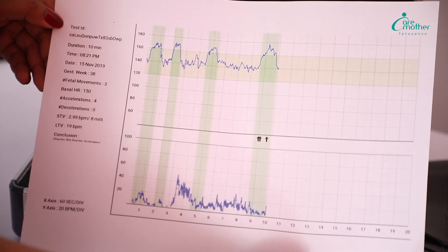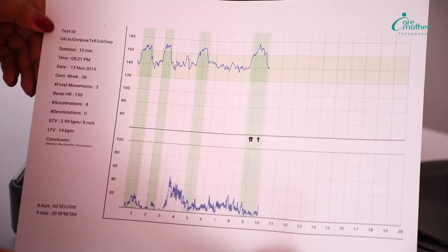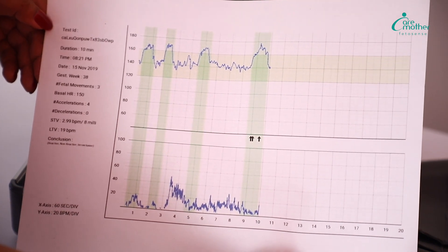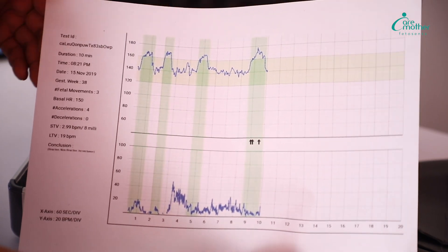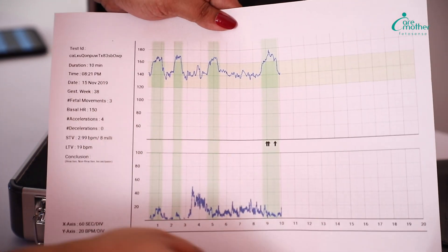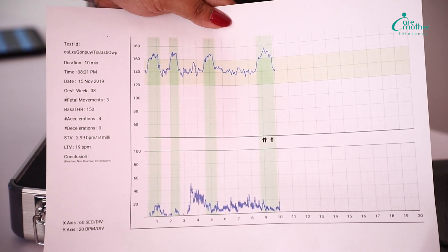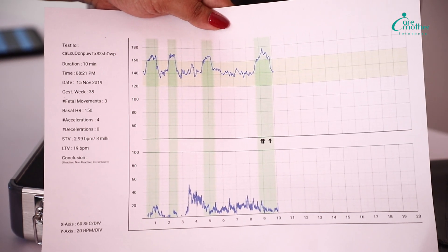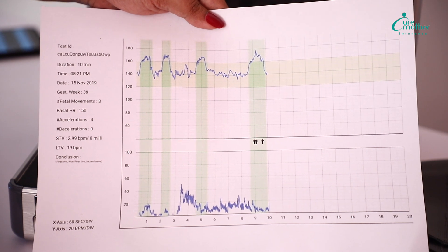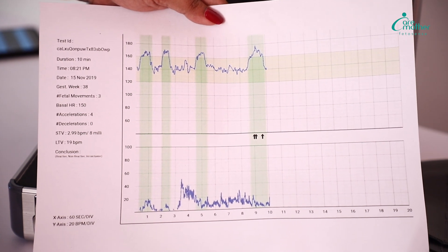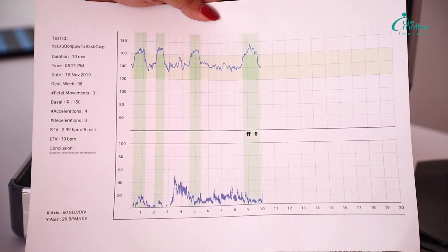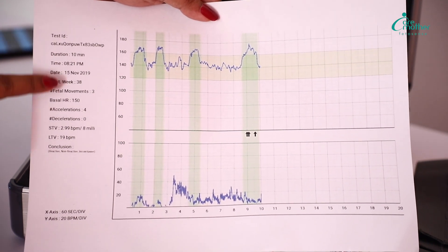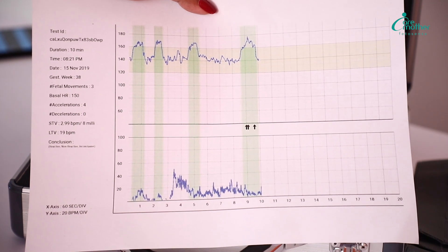This is a normal A4 paper. In landscape, you are able to see 20 minutes of this test. Other than that, the parameters of acceleration, deceleration, STV, LTV and any other parameter which comprises of an auto-interpretation will be visible on the side of the print.